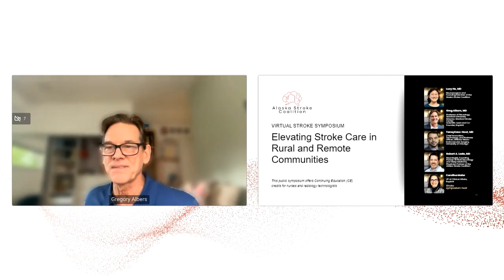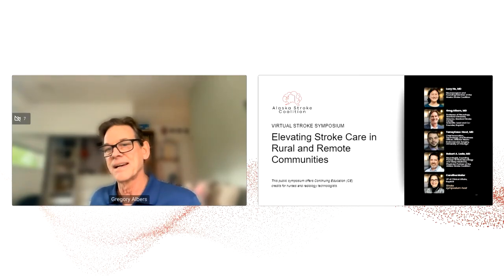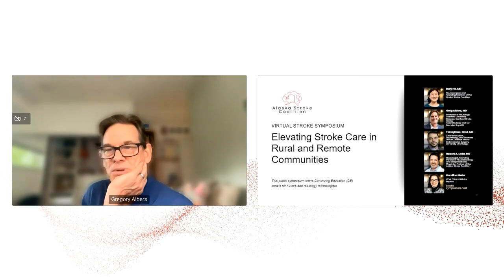where somebody who's in Anchorage can see the images of the outside hospital. At Stanford, we have 10 referring hospitals where we see the images in real time. So the same time they know about a case, we can see it as well. And when they call for help, we can give much better information because we have access to the images through the AI app. So I think it's very helpful to have a team approach where you can have experts viewing the images that come out of those community centers.